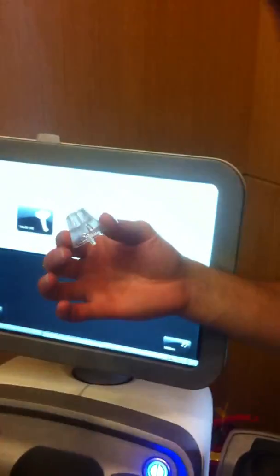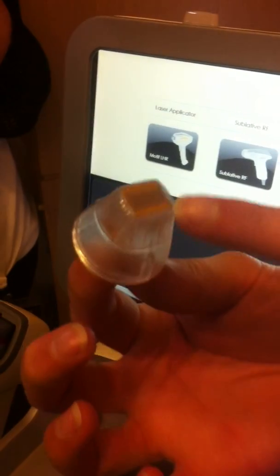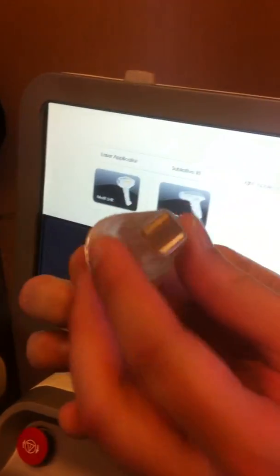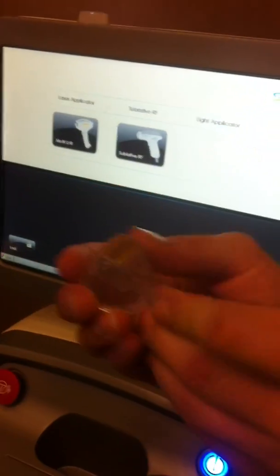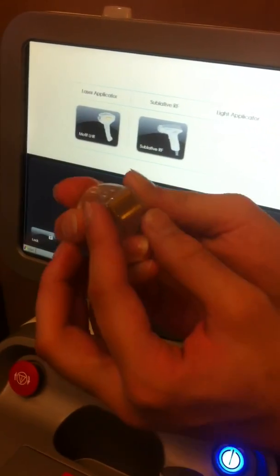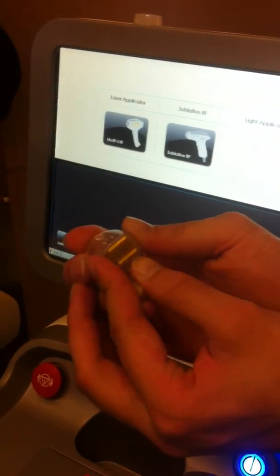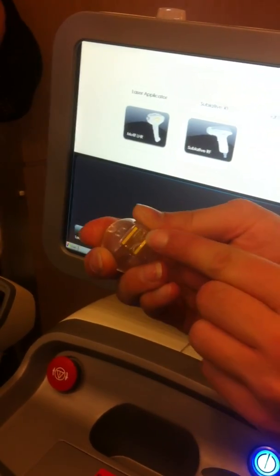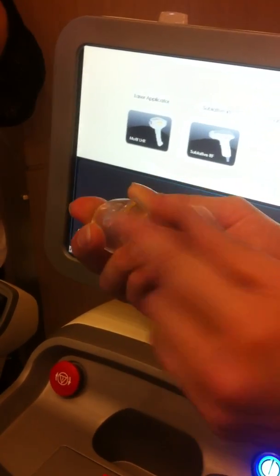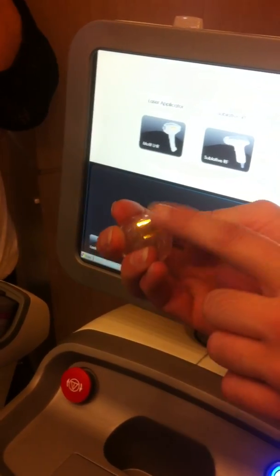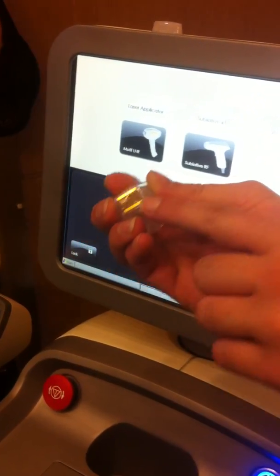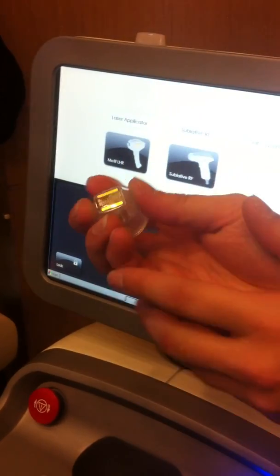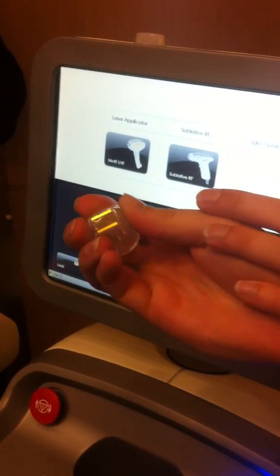Here we have a 44 focal. This is the new focal tip, which is shipping right now. You'll notice a couple things about it. First of all, it uses our new electrode geometry, which is, instead of a 4x, it's a 2x distribution. So you'll see it's rectangular rather than square. There's a couple of reasons for this. One is electrically, technically, and another is treatment-wise.